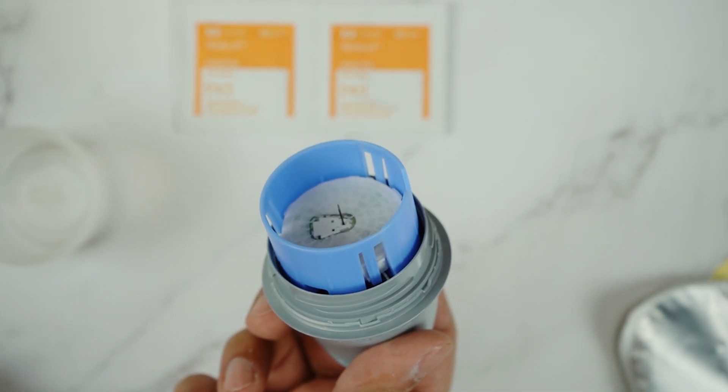Alright, now let's go over how to put this on. In the box you had these alcohol swabs. So first of all, this is the most important thing to remember.